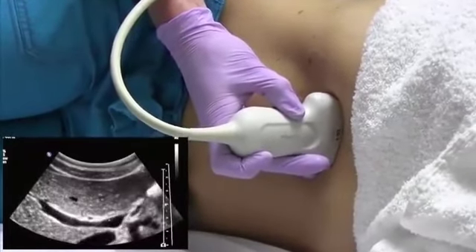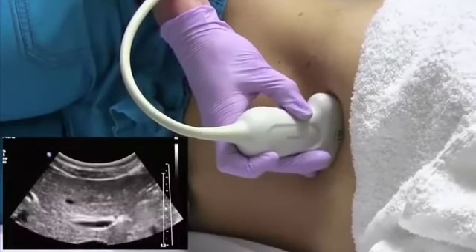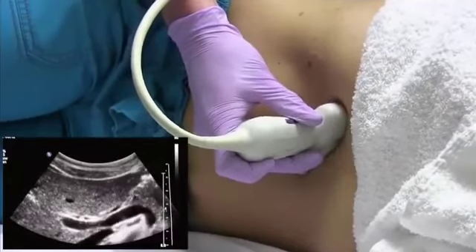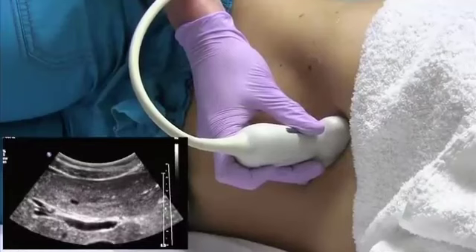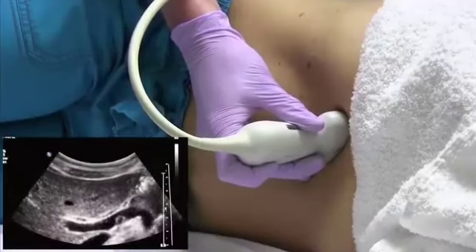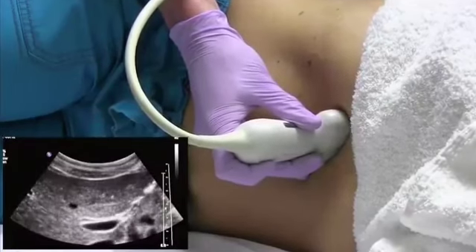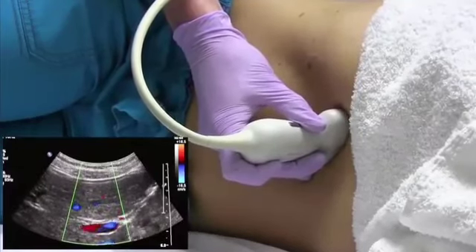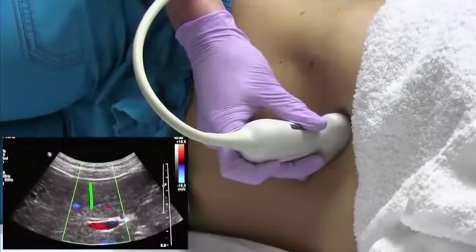Once you find that, you know that the CBD and the hepatic artery are right next to each other here. So you just keep tweaking the probe until you elongate one of these tubular structures next to the main portal vein. The easiest way to see if you're on the hepatic artery or the CBD is to turn on color and see if it lights up. If it lights up, you are on the hepatic artery, and if it doesn't, you know that's the CBD.